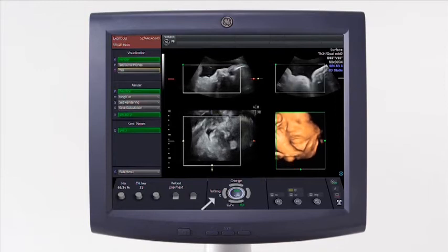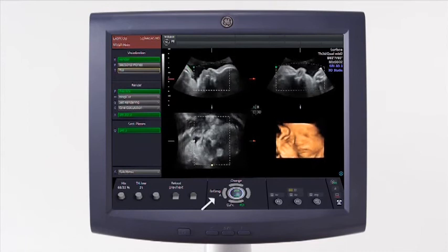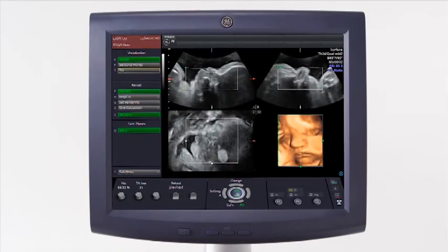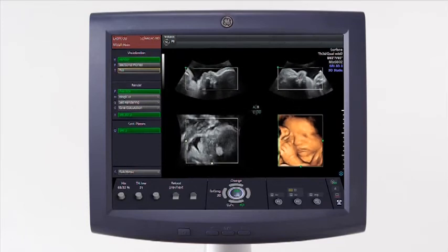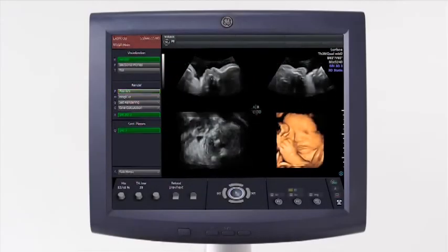These movements are all performed in relation to the reference image, meaning if you size the ROI in the A plane, you'll notice you lose top-bottom information in the rendered image. But if you activate the B plane, that same sizing action now reduces the volume side to side. Notice that zooming the image has no effect on the ROI box when you're in edit mode, unless 3D is selected as the reference image. If you no longer want the contents of the ROI box to be adjusted, select Edit ROI to turn off this feature.